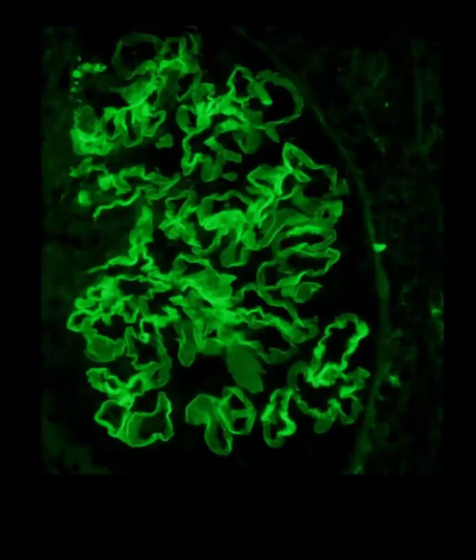Linear deposits can be there in anti-GBM disease, Alport syndrome after the kidney transplant, the cadaveric transplant, fibrillary GN, diabetes mellitus, and SLE in rare cases. Dr. Akil, can you tell me the linear deposits in nephrology?